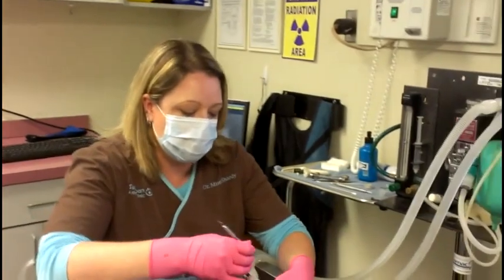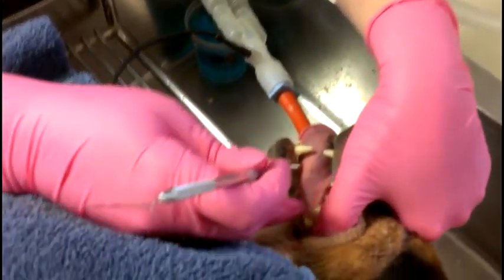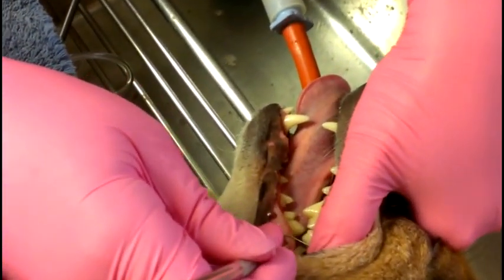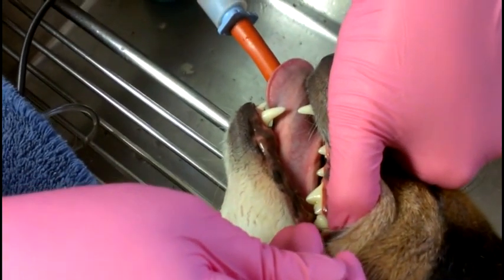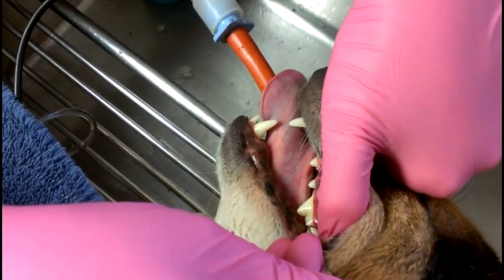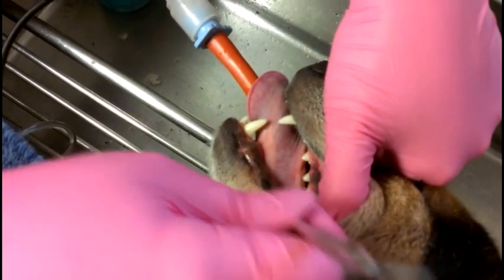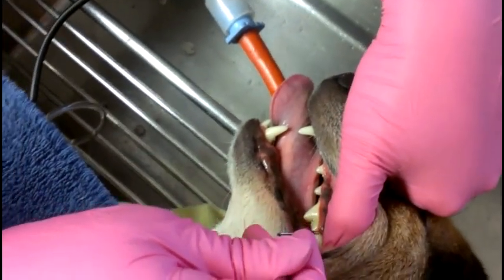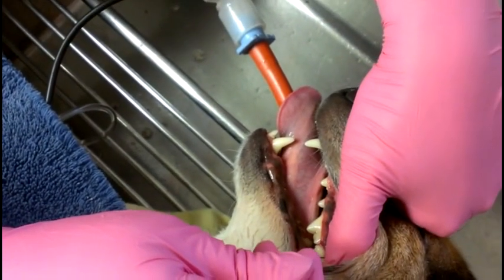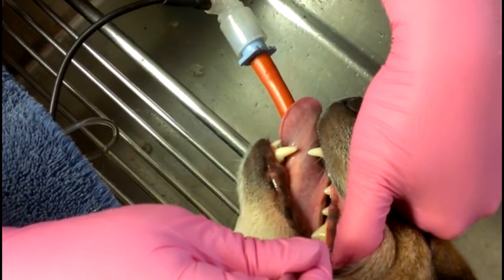And I know Dawna's already kind of gone through this, but we'd just like to have a doctor double check. This is the tooth that she was questioning that had some issues with a little bit of gum recession, a little bit of pocketing around the roots of the teeth. And I took a look at the x-ray, and I don't think that there's anything concerning on the x-ray as far as periodontal disease, but there's definitely some gingivitis, so we'll give her some antibiotics to see if we can help clear that up a little bit.